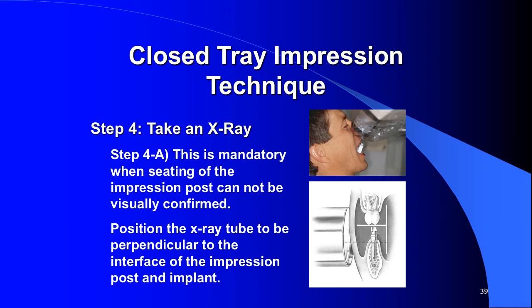Take an X-ray. This is mandatory when seating an impression post cannot be visually confirmed, so we take an X-ray to be on the safe side about the seating of the impression post within the implant.